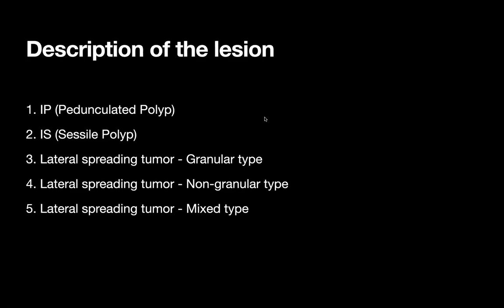So sometimes people can make a mistake of thinking a polyp is a large sessile polyp, which in fact was a pedunculated polyp. And I've seen that in my own practice where somebody thought it was a large sessile polyp. And when you rotate the patient and make the lesion become non-dependent, the polyp actually hangs from the roof. And if there is a pedicle, you will see the pedicle. So that's one thing I want you to keep in mind.